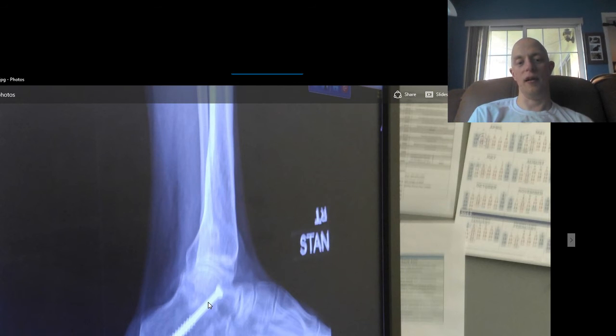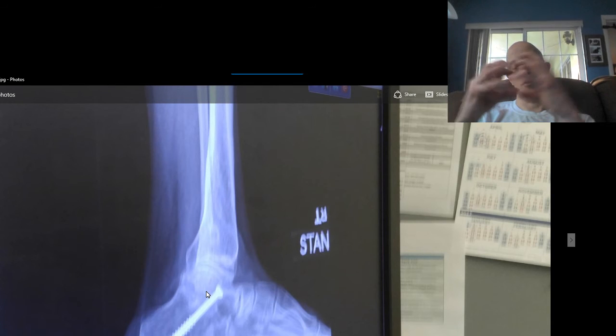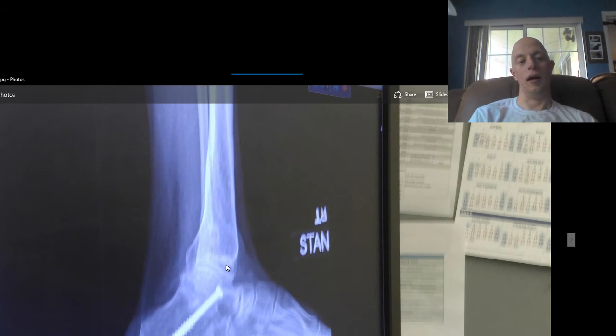Here's the right foot at a side angle. As you can see, the screw is all the way through the top of the ankle and it goes all the way through the back — I believe that's the fibula. All the bones that are supposed to have a space in between them — it's not there.